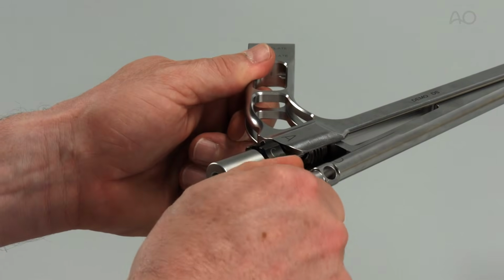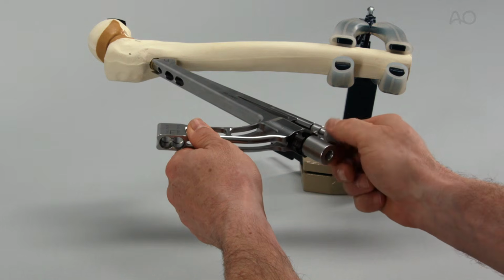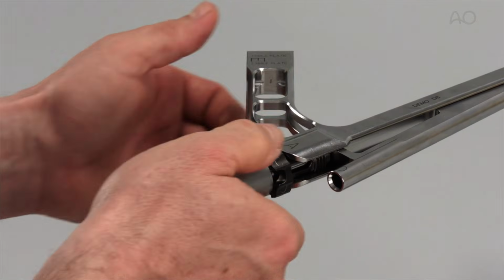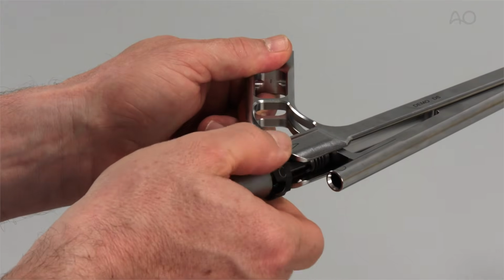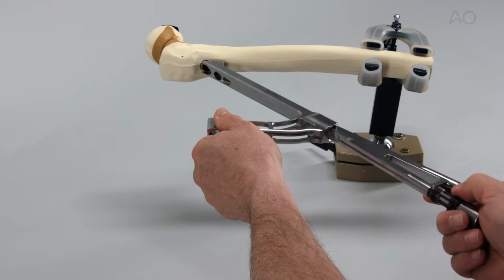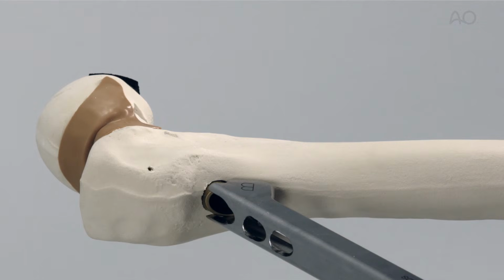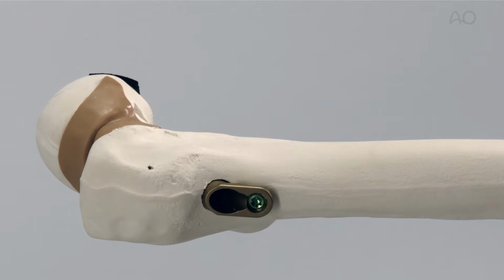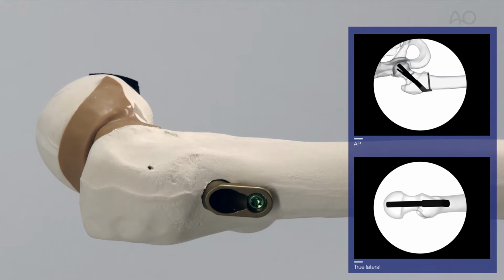The multifunction rod is removed with counterclockwise turns. The screw of the insert is turned counterclockwise manually, and the insert is removed from the insertion handle. The insertion handle is removed from the plate by sliding it off the plate in a distal direction. Clinically, the implant size and positioning would be verified under image intensification before wound closure.